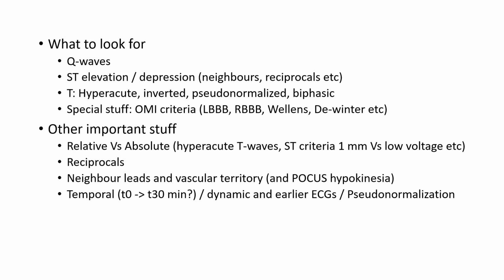Just like when we do neurology, where's my lesion? But as I understand it, this is not as perfect a 1-to-1 ratio. There's a lot of variability in the heart and the vascular territories of the heart, and it's not always that the ECG vascular territories look like what we see when we do the PCI.